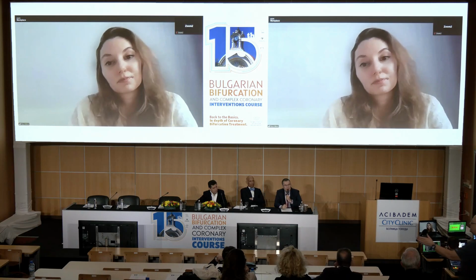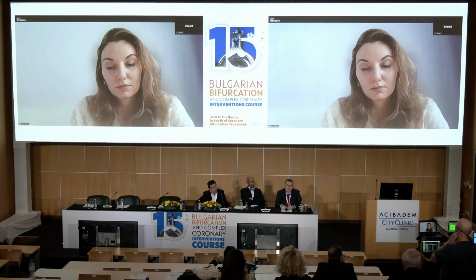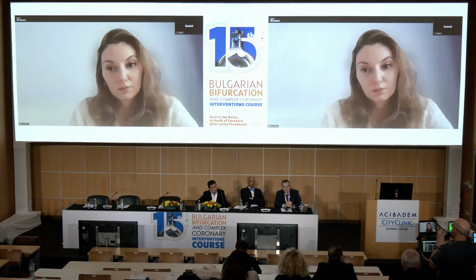Okay. Valery? We're doing CTs for some of the cases, especially with ambiguous anatomy, especially the right coronary, after a failed attempt. But in order to do it, you should have the CT station in the cath lab. Yes. Otherwise, it's not working. And we are working on this. We ordered already. And of course, the interventional cardiologist should get some experience and knowledge of how to reconstruct it, at least how to operate with this, even at the basic level.